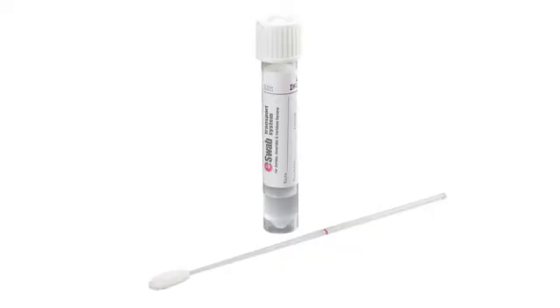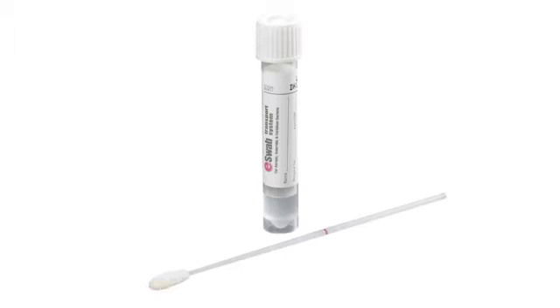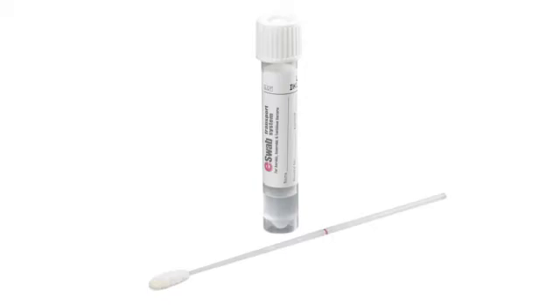If a rapid test is being done, we still need to confirm negative results with culture in children, so there may be a need for two traditional swabs, or a single e-swab will suffice in these situations. Some traditional kits have a double swab included while others do not. E-swab simplifies the process, allowing the laboratory to run multiple tests from one swab.